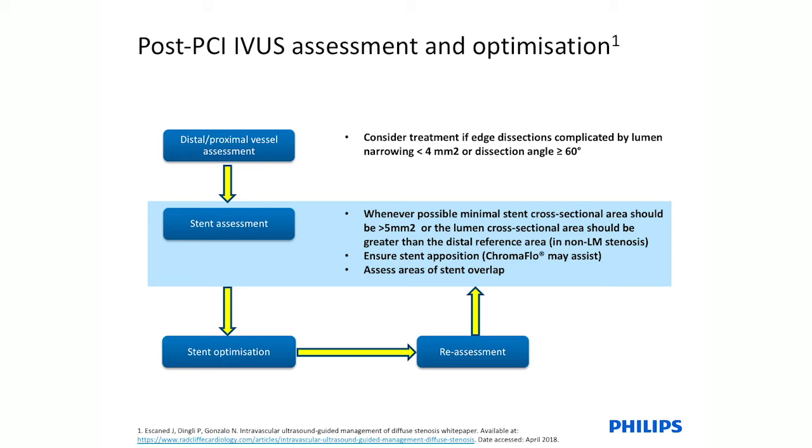Again, all this has to be put in perspective, and has to do also with the location of the segment that you are working in, whether the proximal or the mid segment of the vessel, and also with the characteristics of the atheroma in that particular part.